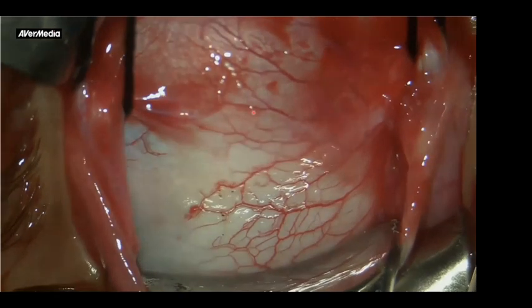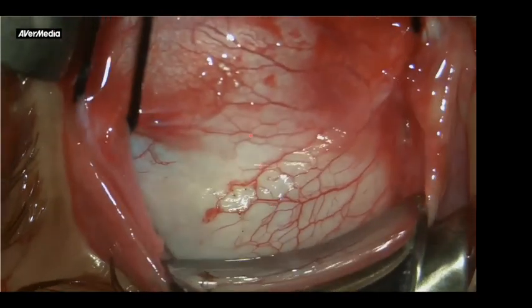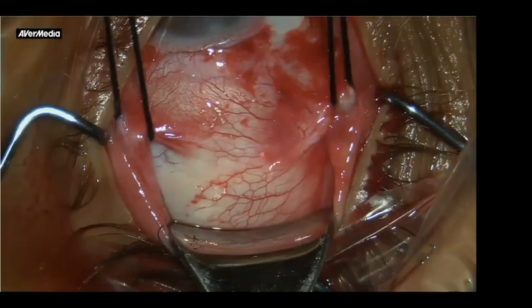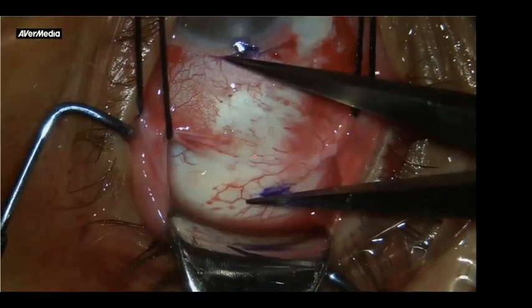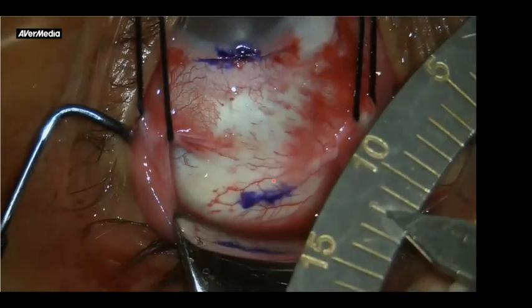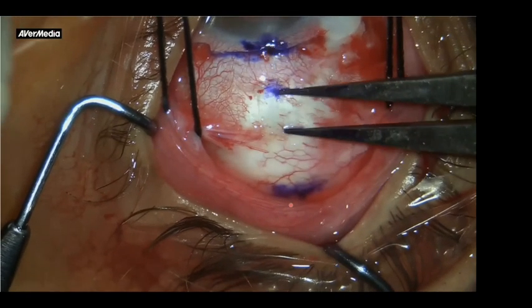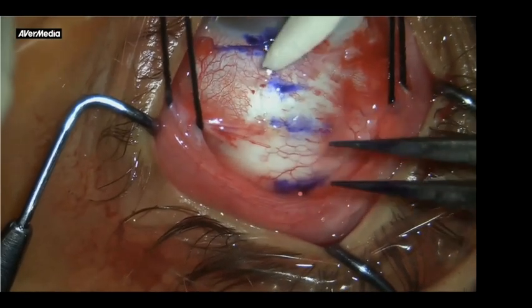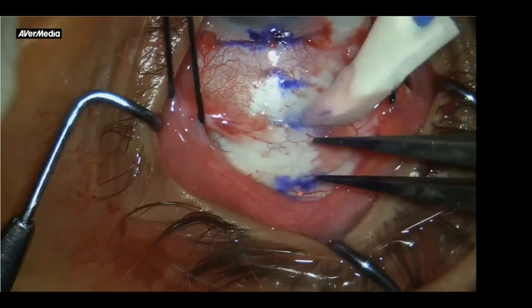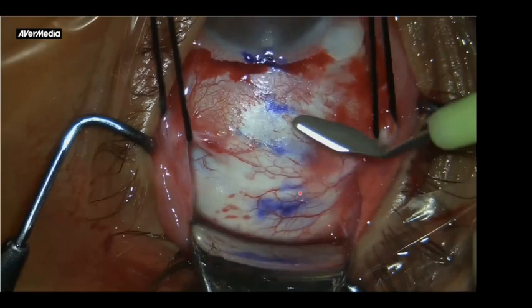Now I like to see the sclera, and then I do diathermy as needed. And I retract the tissues, and then I measure 12 millimeters. Once the exposure is like that, I really feel happy, and I feel that I'm comfortable with the tunnels and the suturing. Then I'm dividing into three millimeter tunnels, as all of you see, just a landmark. And then I'm going to use the crescent.